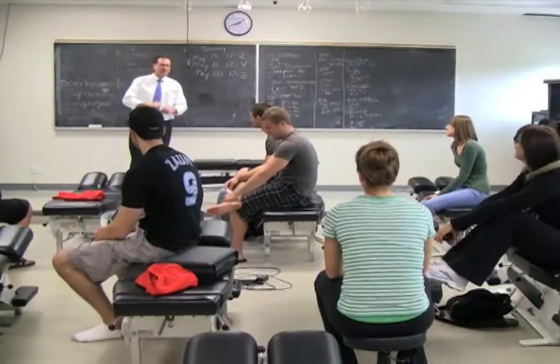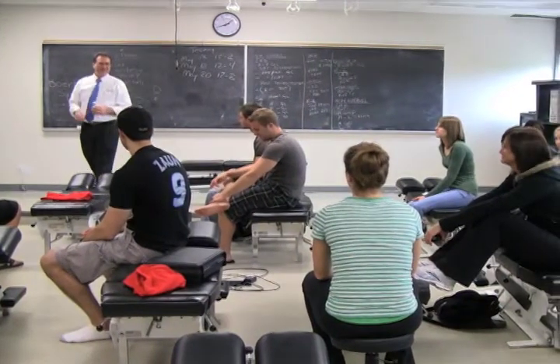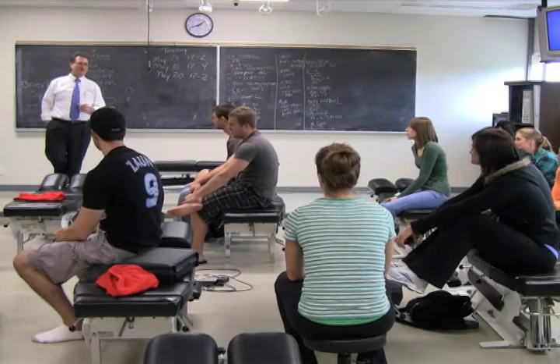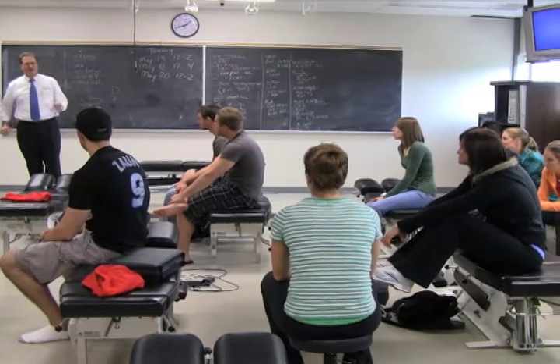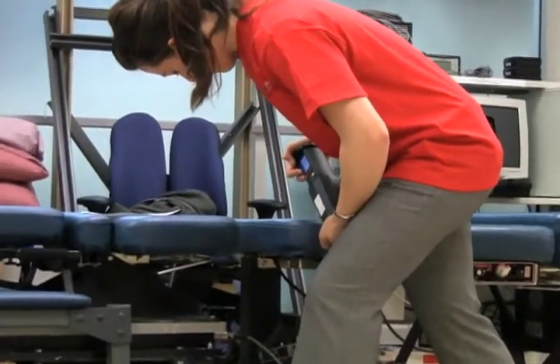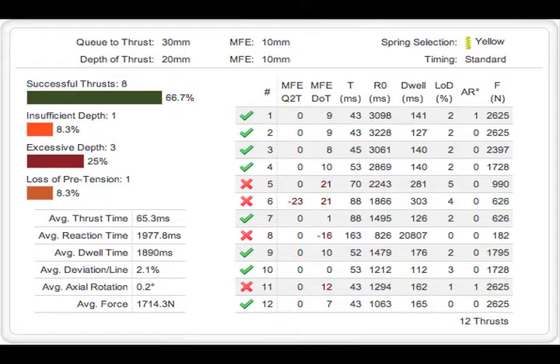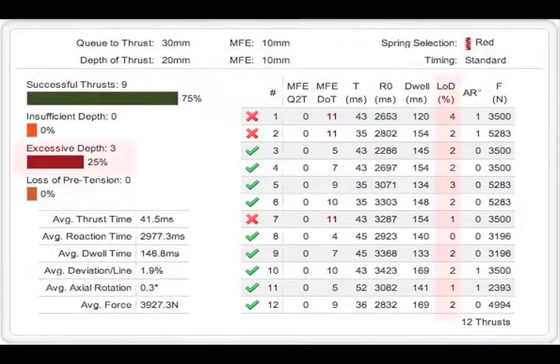After the professor has evaluated the uploaded set that we have just seen and instructed the student about what to do in order to overcome the problems, the student performs the remedial work on his own time and, when ready, uploads sets of the same exercises. With these new sets of exercises, we see that the problem with the lost tissue pull is virtually gone. The line of drive accuracy and depth control is vastly improved.